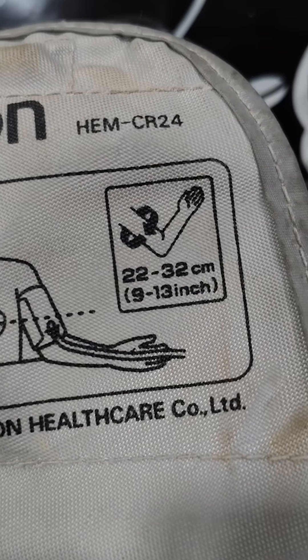Rule 4: Your cuff shouldn't be too small. A standard cuff fits around 32 cm arm circumference. Your cuff should be at least 2 cm above your elbow crease, placed directly on the skin and not on your clothing.